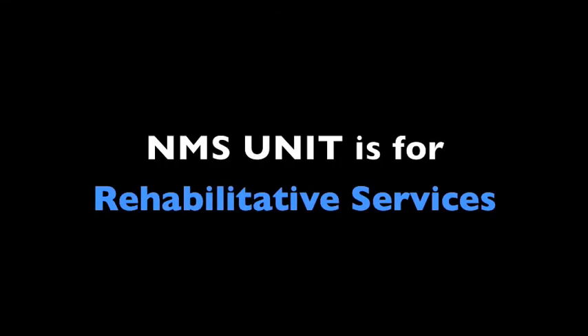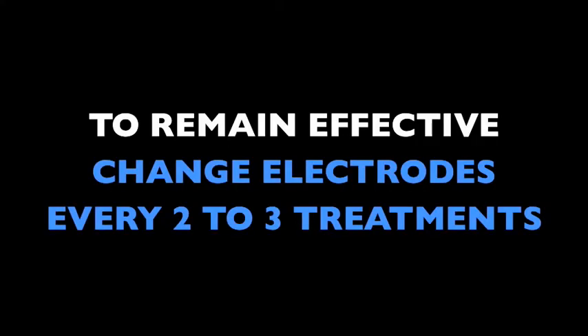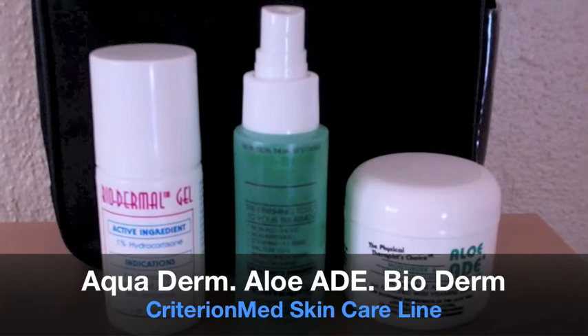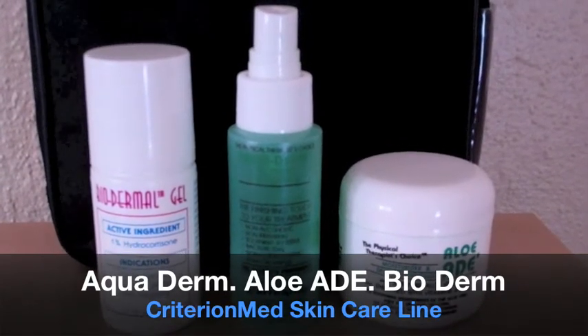The NMS unit is for rehabilitative services. The TENS unit is for pain management. Please remember, to remain effective, electrodes must be replaced every two to three treatments. Before using your device, be sure to familiarize yourself with our three essential skincare products: Aquaderm, Aloe ADE, and Biodermal Gel.